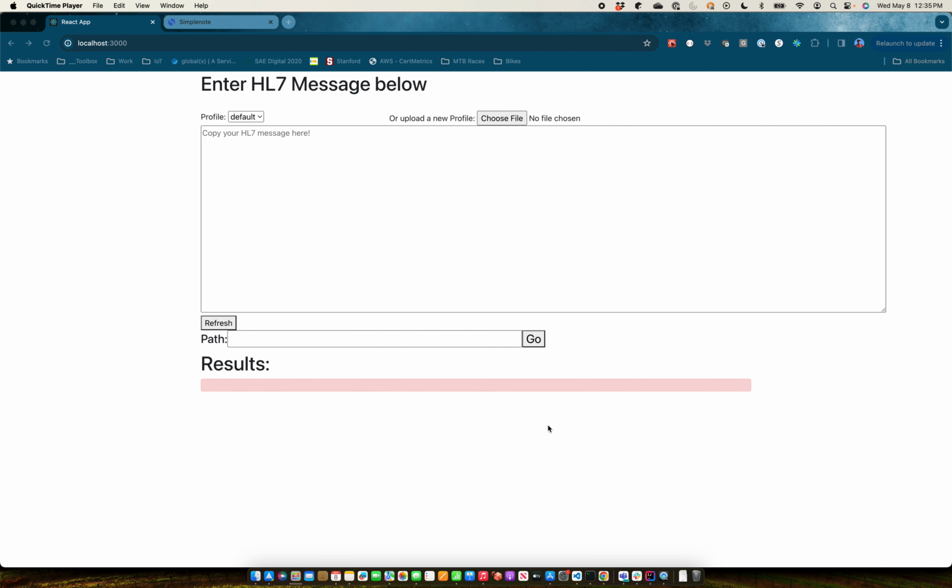So it doesn't try to parse the entire HL7 message into a complex graph of objects trying to understand every single needy detail of it. On the other hand, it relies on string parsing and regular expressions to find information out of HL7 messages. It doesn't matter which flavor of HL7 message you're using. Basically, if it's a well-formatted HL7 message, where you have your segments and the fields are pipe delimited, your components and subcomponents, etc., this library should be able to extract information out of HL7 messages.